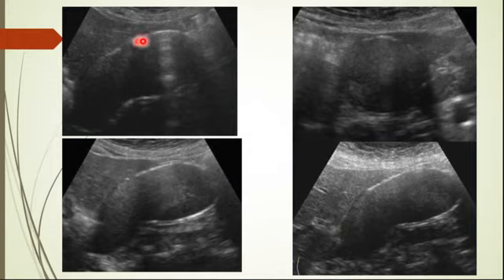You can see here, this is a porcelain gallbladder. Again, we have a calcified gallbladder wall. There is no wall-echo-shadow triad. Okay, and it should not be confused with air either. Keep that in mind. When you move the patient, it does not move. It stays in the exact same location.